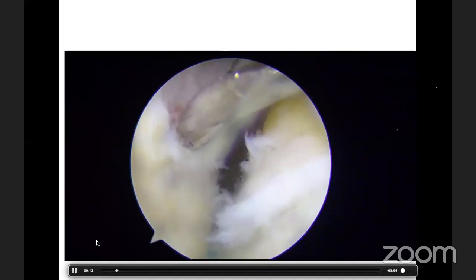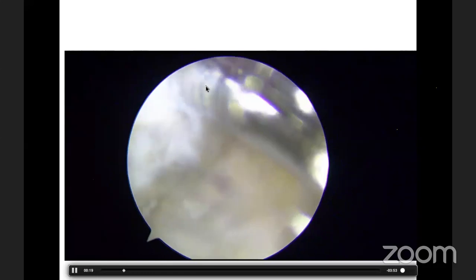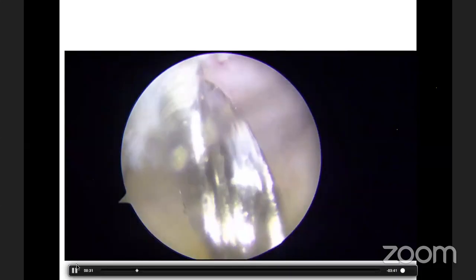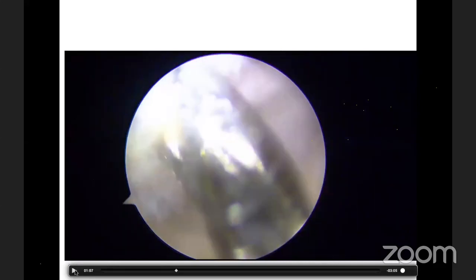Once the guide wire is passed, the accessory anteromedial portal is used for the femoral footprint. The ACL footprint was identified and the guide wire was passed. Then reaming of the lateral femoral condyle is done — this is the reamer used for reaming. You can see the depth and length of the femoral condyle with this reamer.